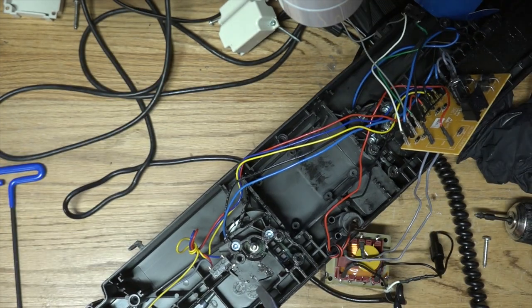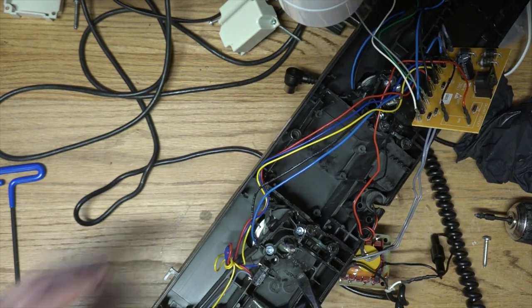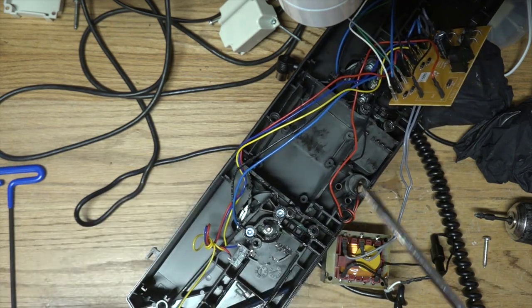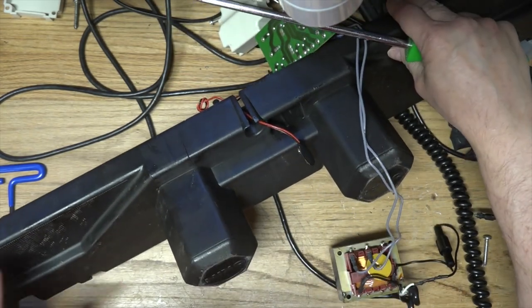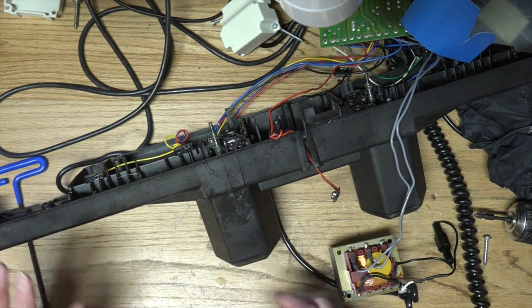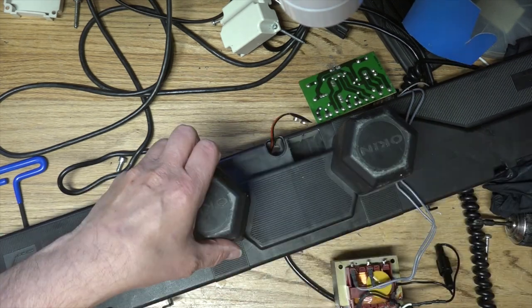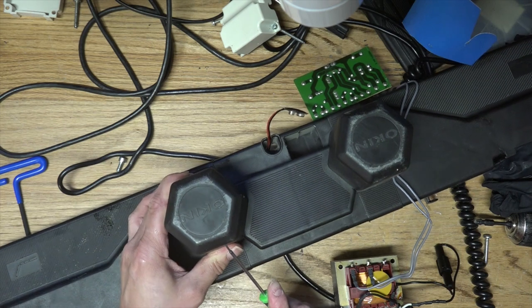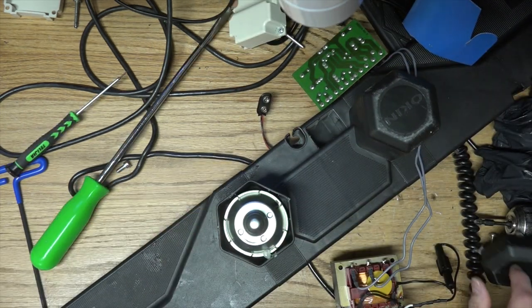Does this whole cap assembly pry up here, maybe out of the case? Doesn't seem like it. No, it ain't moving any place. Let's turn it over, and we are unplugged. Let's see if, here. There's a separation back here at the back of the motor canisters. So let's take a look at that. This is a very small Phillips. Let's see if we can just start it going with that guy. There we go. That's off. It looks like it was hot glued in there a little bit.